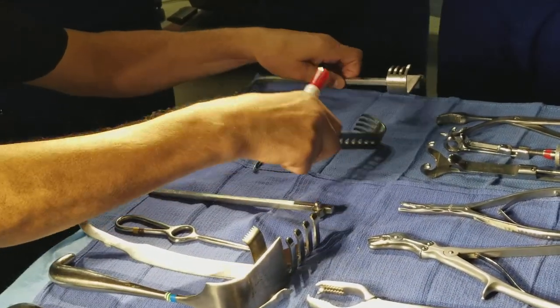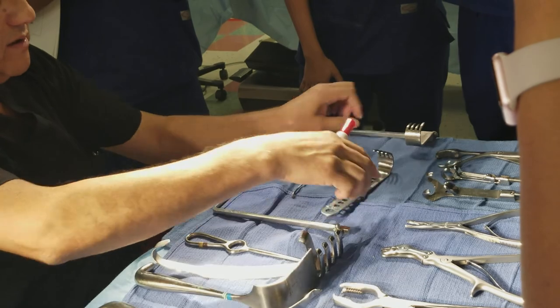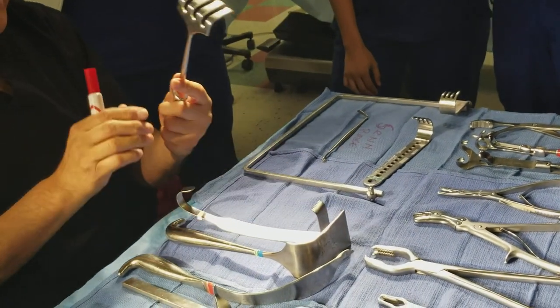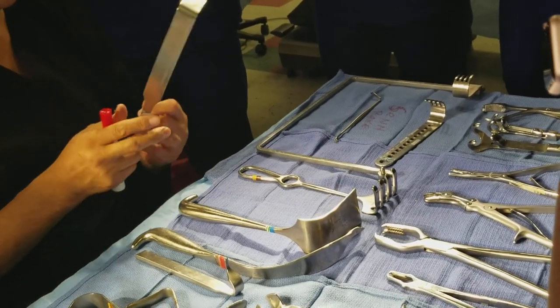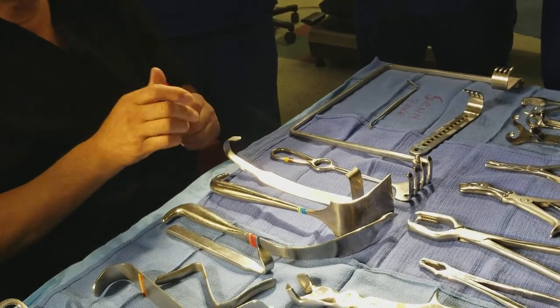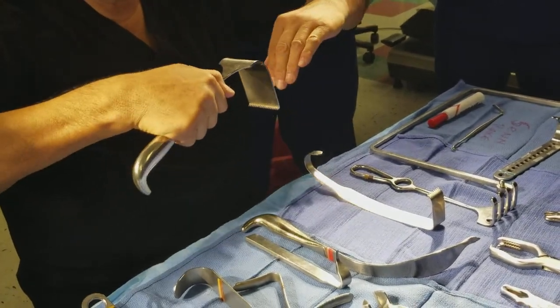Once the incision is open, they'll put this in like this and spread the tissue open so you can see the head bone in there. It's a self-retained retractor. Here is the Israel rake — it's a big retractor for big hip surgery. Here is a hibbs retractor. All these are used to retract tissue back.